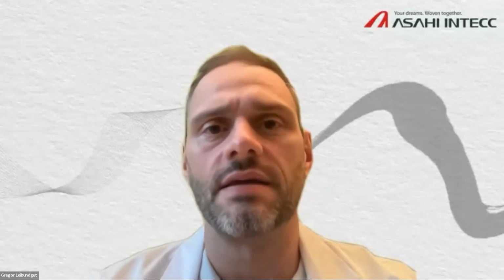Good question. My first Antegrade wire choice is a Fielder XTR actually, or XTA, which is a taper tip, polymer jacketed softer wire. And as you showed in your presentation, even though you don't expect it from the anatomy or from the angiogram, it usually or very often just passes and you're done.